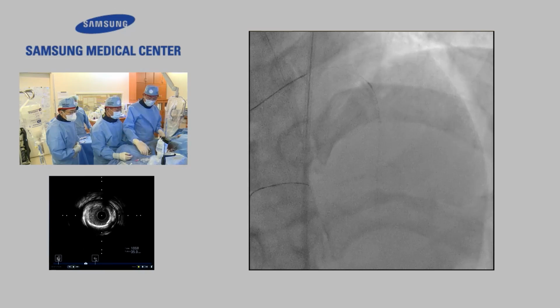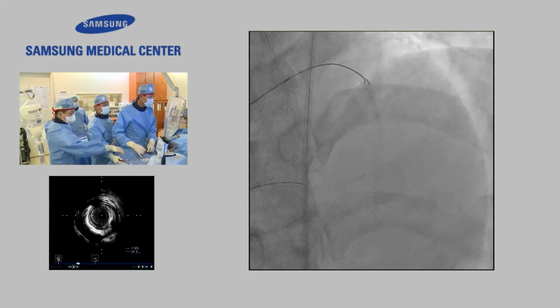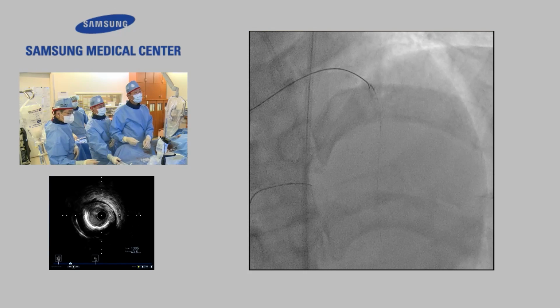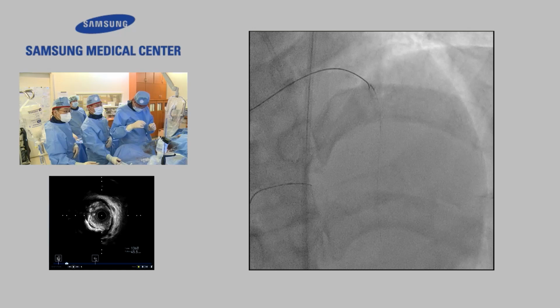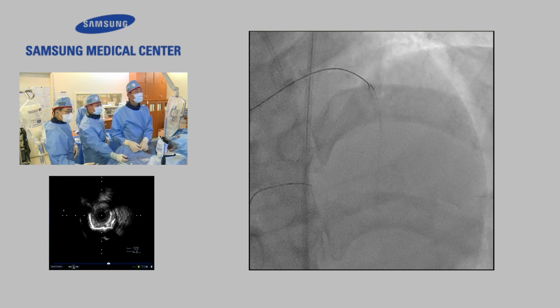I'm sorry, I may misunderstand your comment. So don't you make any rotation before the diagonal branch wiring? Because, actually, this is eccentric calcium, so I don't think we need rotablation here. It's a very short 1 or 2 millimeter length of napkin ring.